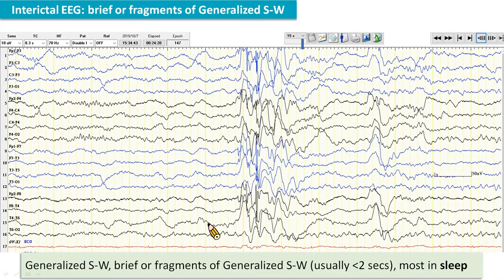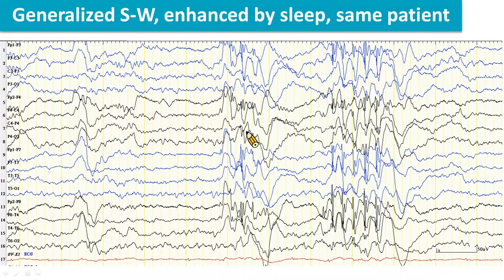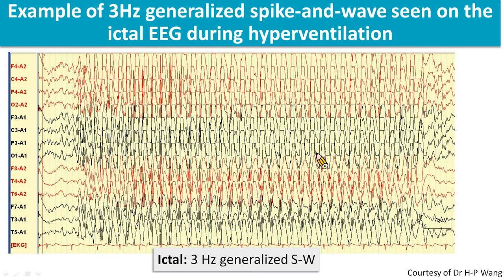Generalized spike and waves are seen in the interictal EEG. These are brief, usually less than 2 seconds, and most commonly seen in sleep. The epileptiform discharge could be provoked by several conditions including sleep or sleep deprivation. This slide and the next show the epileptiform discharge enhanced by sleep. This is an awake EEG which shows normal background and hardly any epileptiform discharge, while during sleep there are bursts of generalized spike waves.